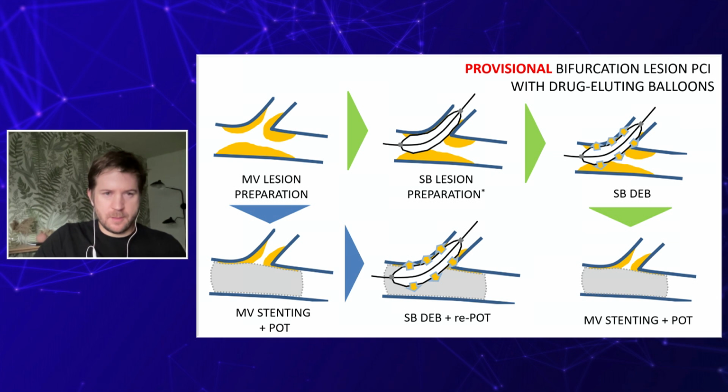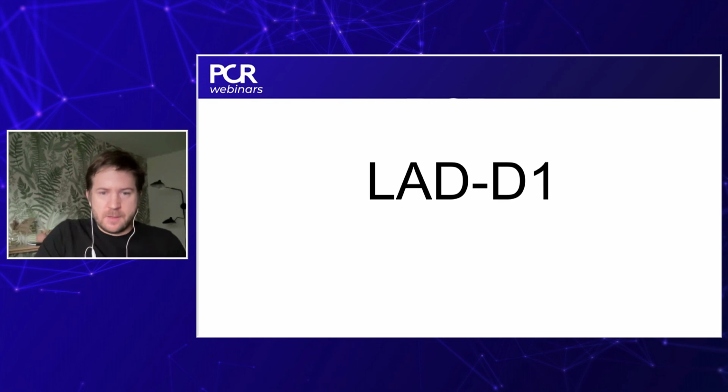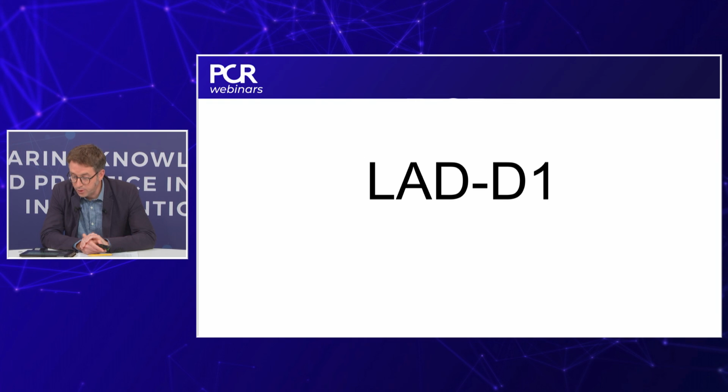case? Sure. So I think the most important thing here, as Thomas also said, is that you start with lesion preparation and keeping open for different options. You have to achieve proper lesion preparation, actually, regardless whether you will put stent or put DCB at the end. But you have to achieve a good result after lesion preparation to decide how you want to move on afterwards with the stenting or DCB.